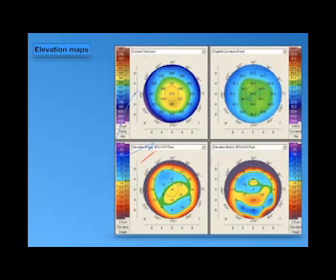We have the best fit sphere is the common map used for all. But in case of high astigmatism, if we have any abnormal maps, either the curvature map, which is the topography, or the elevation, we put it on the ellipsoid fit sphere.